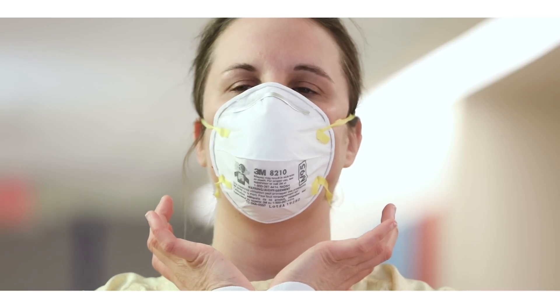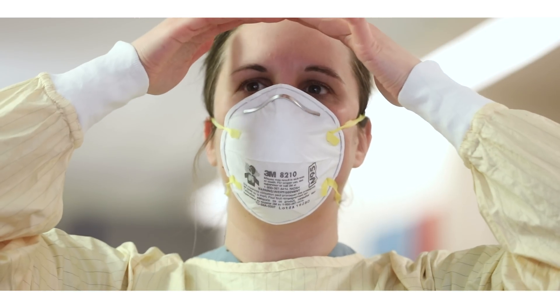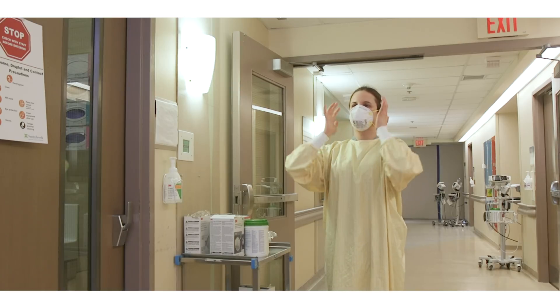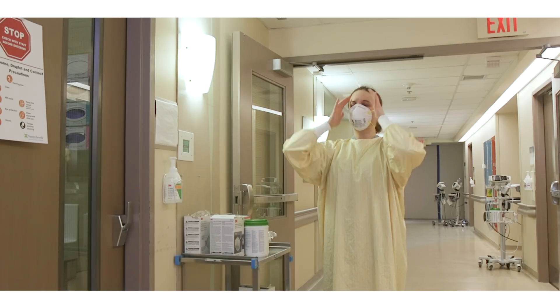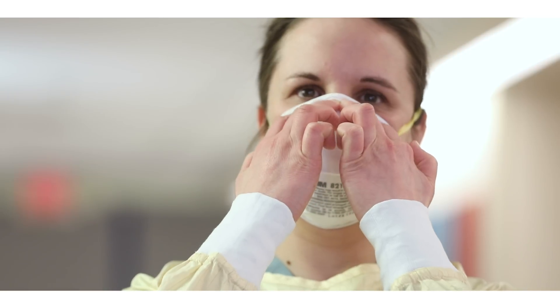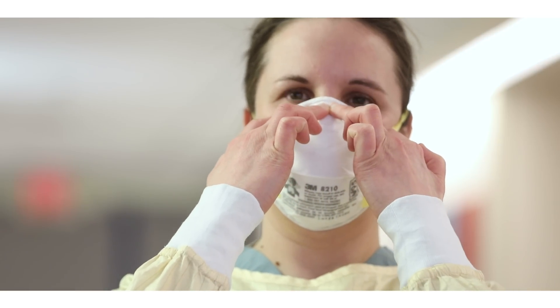Perform a seal check by placing your hands at the side of your face at eyebrow level without touching the mask. Exhale quickly once to check if air escapes the mask and hits the palms of your hands. If you feel leakage, readjust the fit of your N95 respirator and perform another seal check.